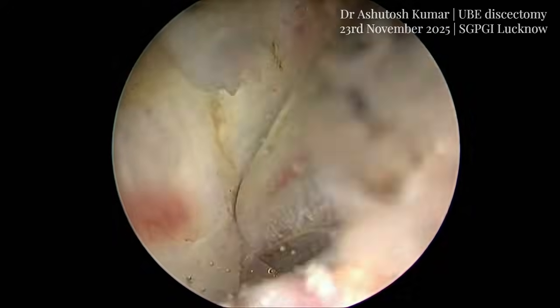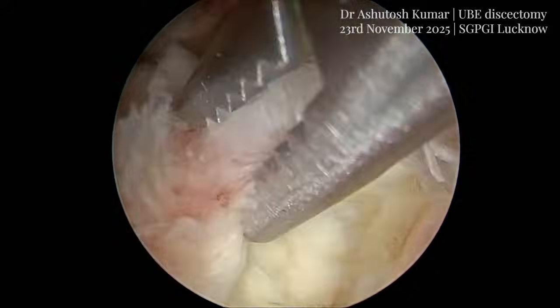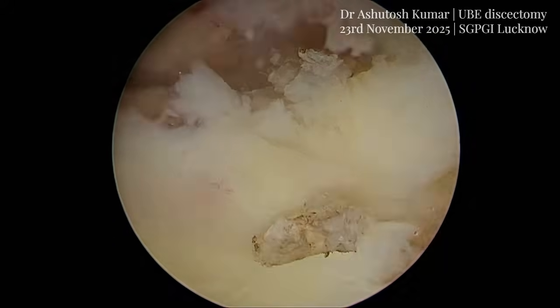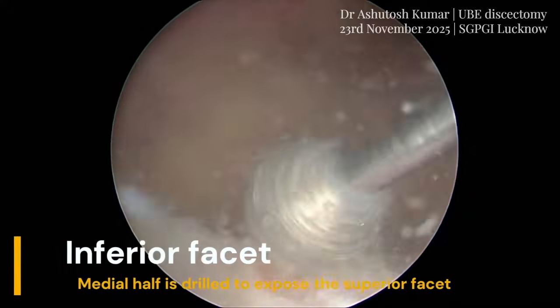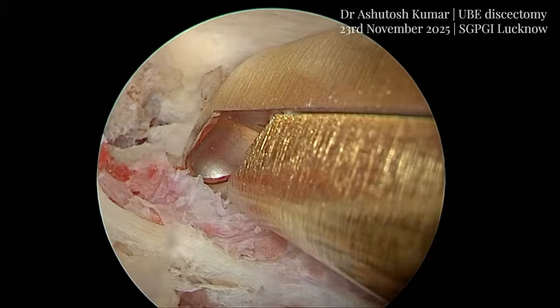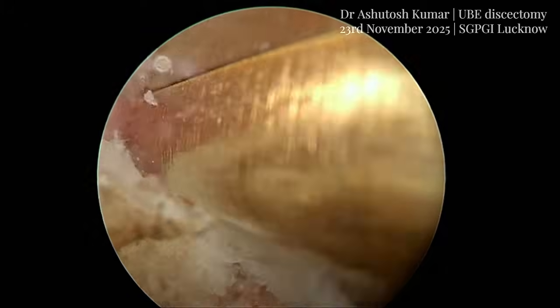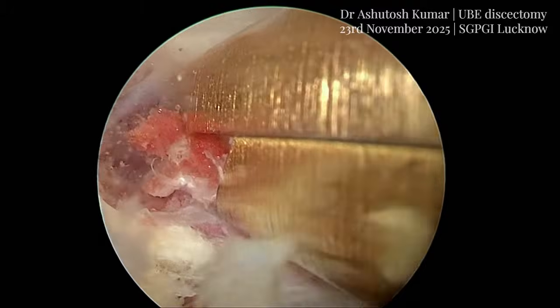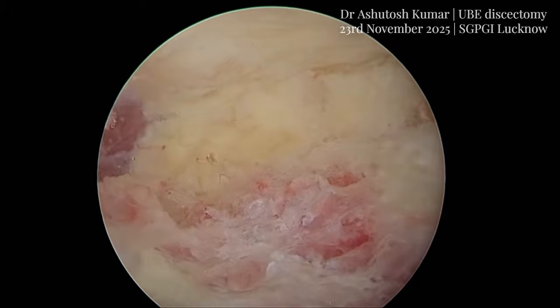The superficial layer of ligamentum flavum was removed, starting from the lower lamina, resulting in significant expansion of the working space. The medial half of the inferior facet was drilled, exposing the medial aspect of the superior facet, which marks the lateral attachment of the deep layer of ligamentum flavum. The ligamentum flavum was subsequently disconnected circumferentially following a Z sequence, allowing controlled and safe decompression.